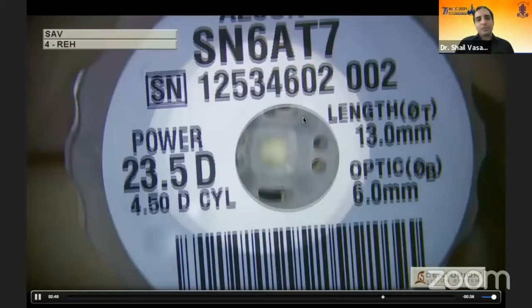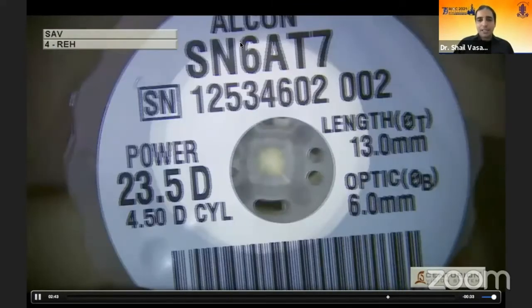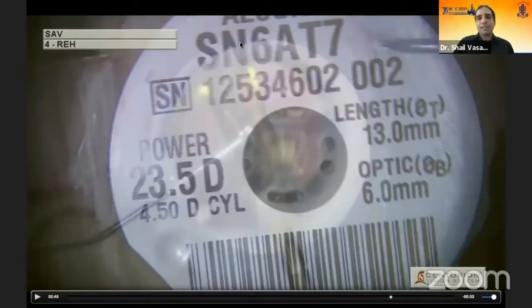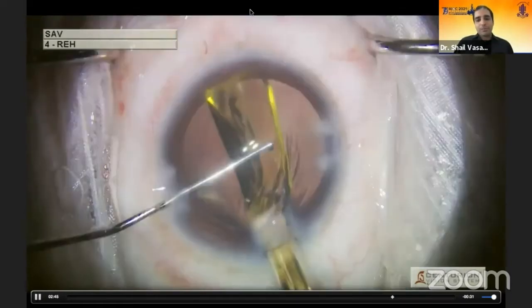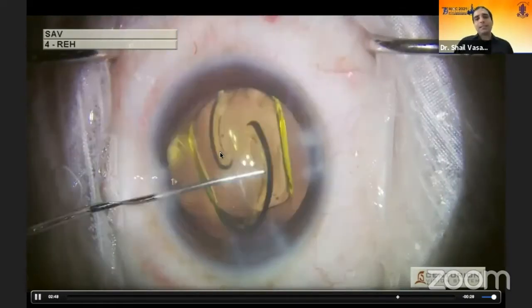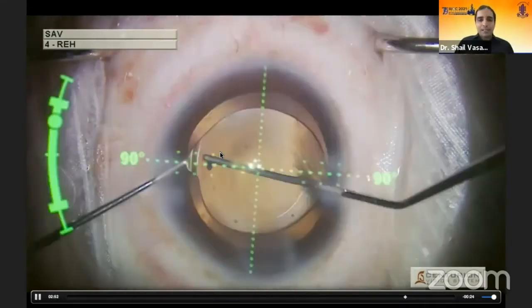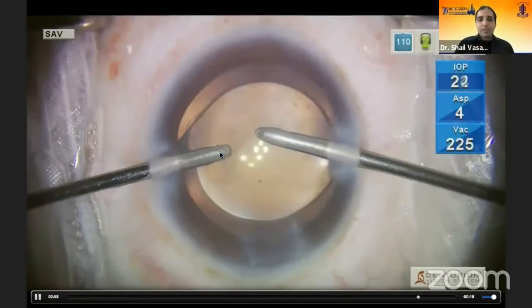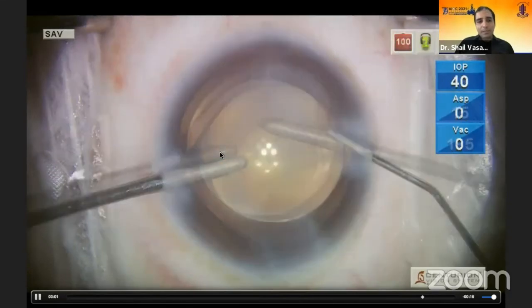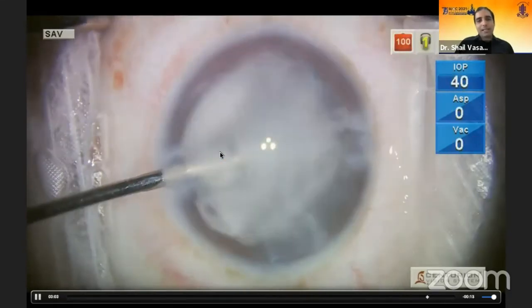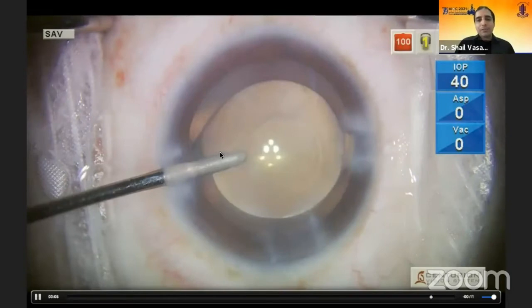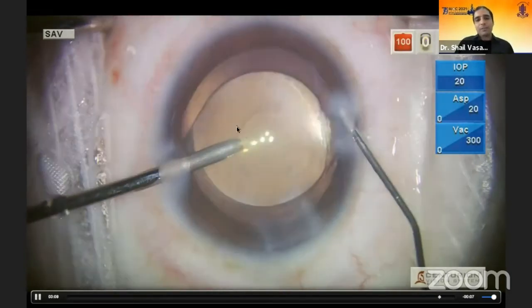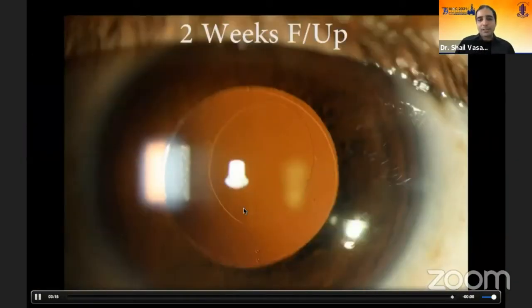We now have an intact anterior and posterior capsulorhexis. This patient required high astigmatism correction, so a T7 toric IOL was planned. Because we have strong margins, in-the-bag implantation is still viable. The stability of these IOLs is well known, even in open posterior capsules — we have publications on pediatric toric cataract with open PCCC. The patient was followed up at six months without any rotation or decentration.